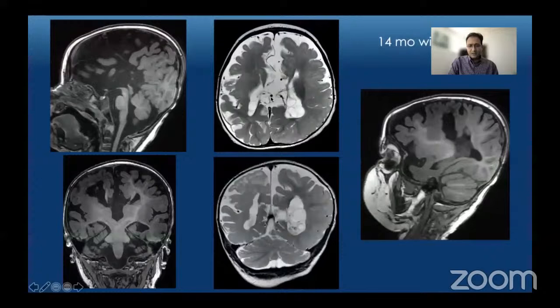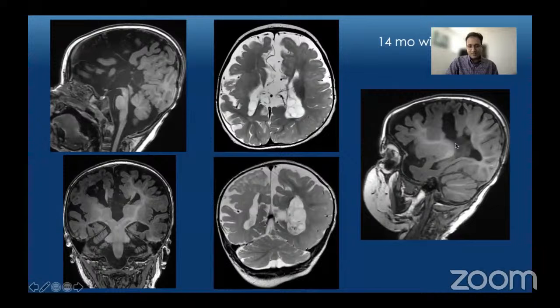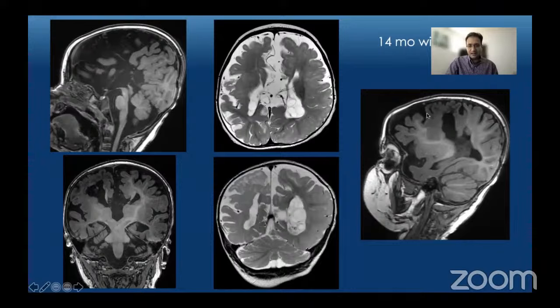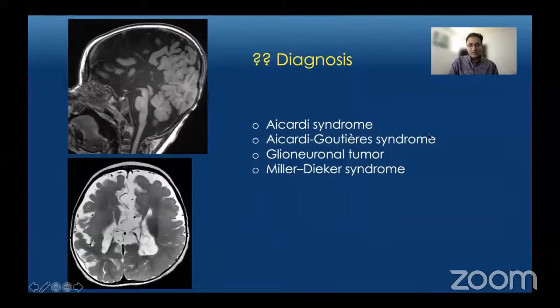The patient also has many other abnormalities including multiple cysts in the lateral ventricles and possibly in the inter-hemispheric fissure. These cystic structures are visible on the sagittal T1-weighted image as well. The cortex and gyral contours are very abnormal with broad gyri and shallow sulci in the right frontal region, associated with a large mass-like area of gray matter heterotopia. The question is: is this Aicardi syndrome, Aicardi-Goutières syndrome, a glioneuronal tumor, or Miller-Dieker syndrome?